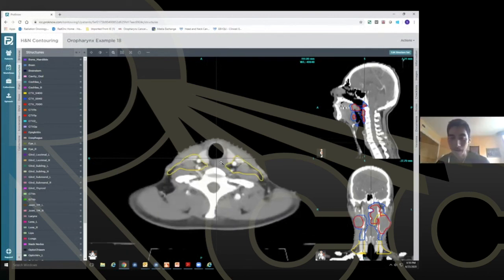And we have another good question, kind of related to what you were talking about, the bolus. For a lymph node that's very, very bulky, sort of pushing right, obliterating the fat space, we recommend the bolus in order to deliver an accurate and high dose of radiation close to the surface. Would you put the bolus on at the start of simulation, or would you put it on after planning?